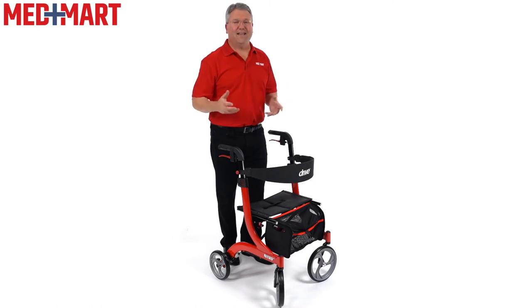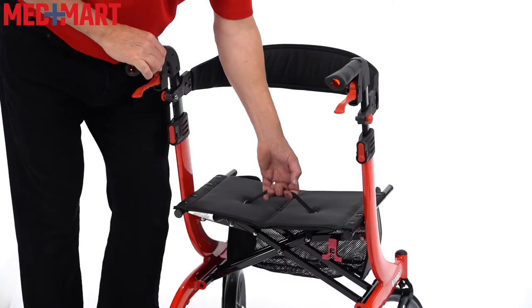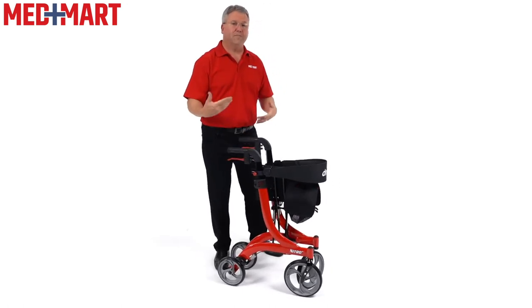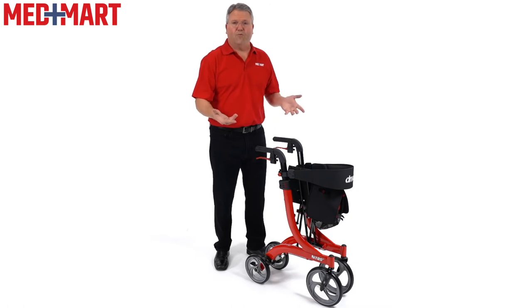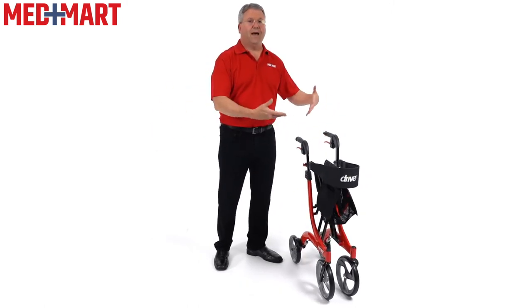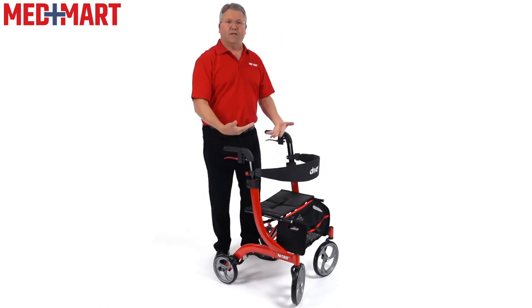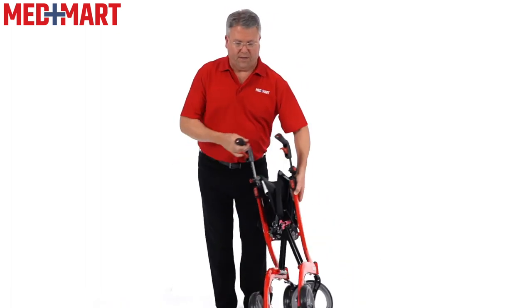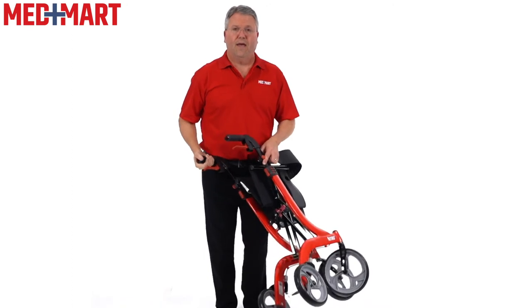Another nice feature of the Drive Nitro Walker is how easy it is to fold. Simply by pulling up on the handle, there's a scissor mechanism in the middle that folds together, then a latch locks it at the last second — you can hear that extra little snap as the mechanism locks it in place. This is really nice because if I'm out to dinner and want to put the walker next to the table, I don't have to worry about it falling over, which happens with most standard four-wheel rollators. When I'm ready to use it again, I give it a little pull, it starts to unfold, push the seat down and it locks in flat. Because of how easy this is to fold, I can easily fold it up and put it in a car — whether the trunk or back seat — making it very easy to travel with.